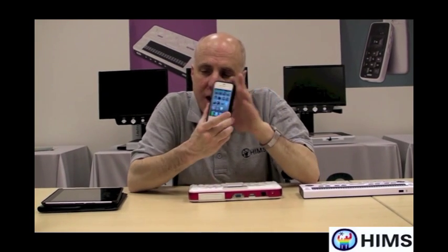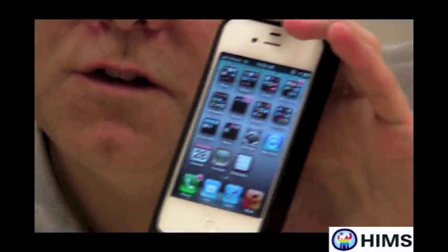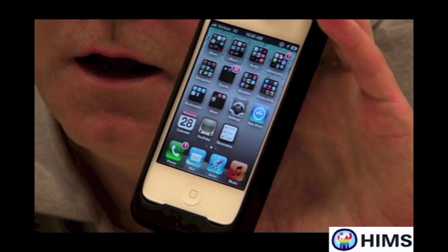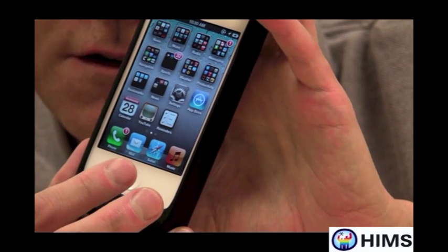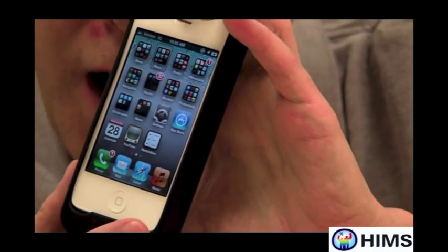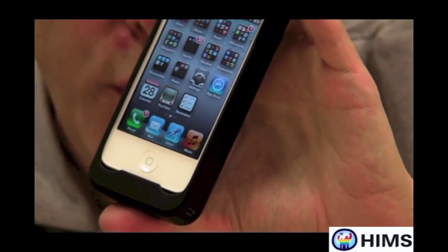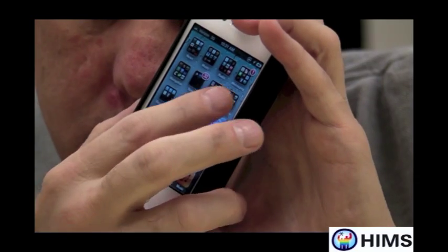So the first thing that I need to do is find Settings. And actually, before I even do that, let me just remind you that you want to make sure that VoiceOver is turned on on your iPhone. To do that, you simply press three times the home button on the bottom portion of your iPhone. That means that my VoiceOver is fully working. And I'm going to go into Settings and double tap on Settings.